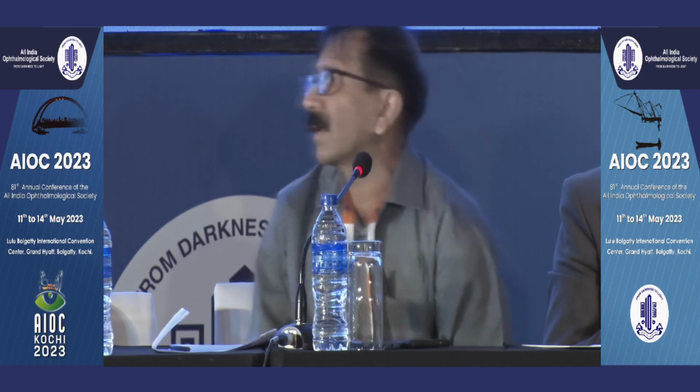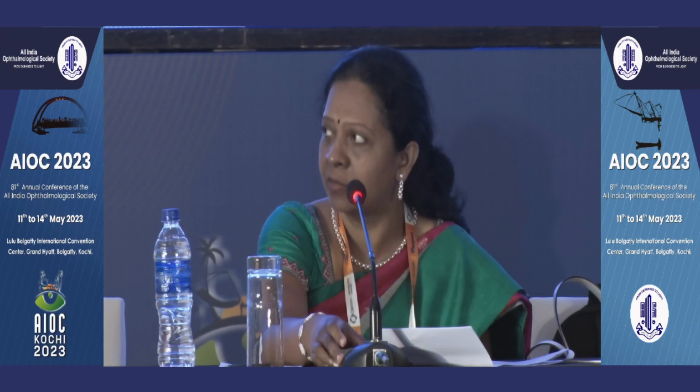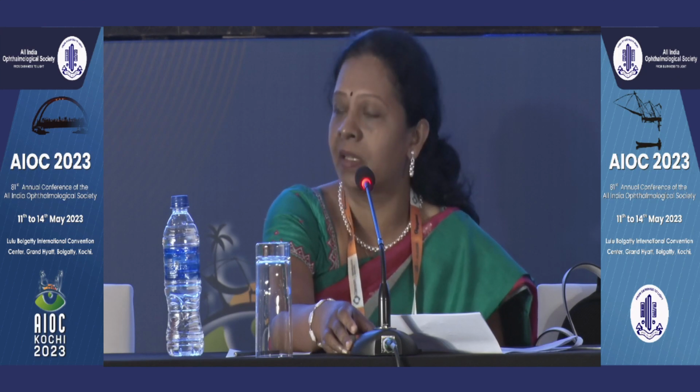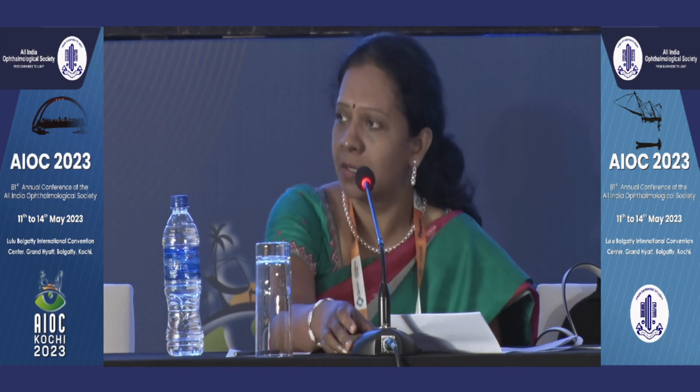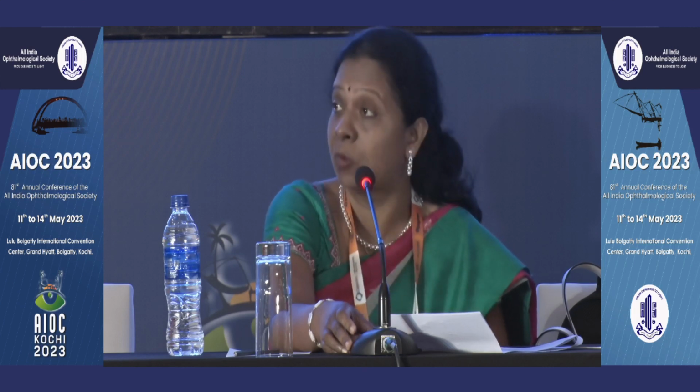These are well-known factors which influence the field result. So I don't know what is new in the study. Even all the patient-related factors are well known. Age, everything can influence, because the field test is patient-dependent. The patient has to do the test, should concentrate, and should have an understanding of the process of doing the fields. So these factors are well known, so that's why the reliability indices are there. Even systemic problems in the patient could influence. Those are also patient-related factors.